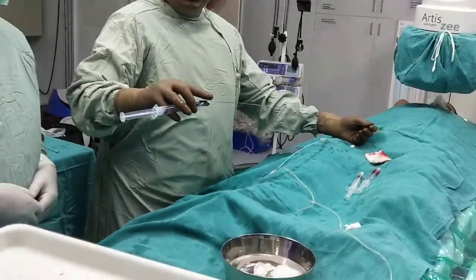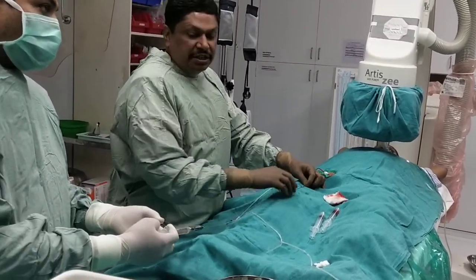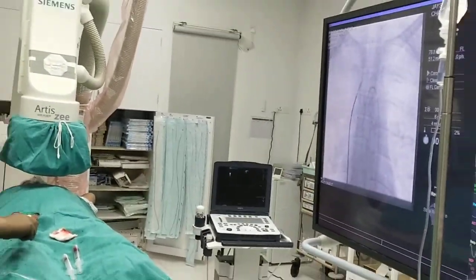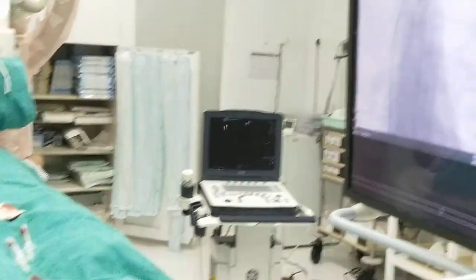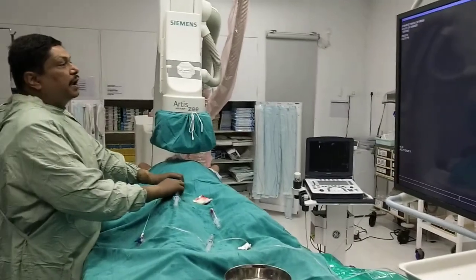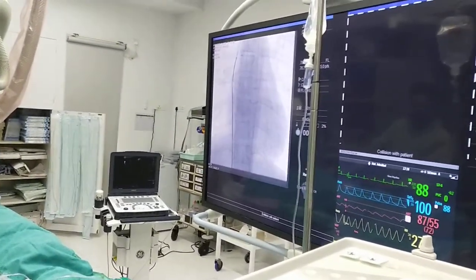We will position the arrow in the three o'clock position. The transseptal needle has to go in the three o'clock position inside the SVC, about two fingers away from the Mullins sheath — that should be the aim, roughly one and a half to two fingers away from the Mullins. We attach dye to the transseptal needle so it will be visible. Now we will descend down into the right atrium.